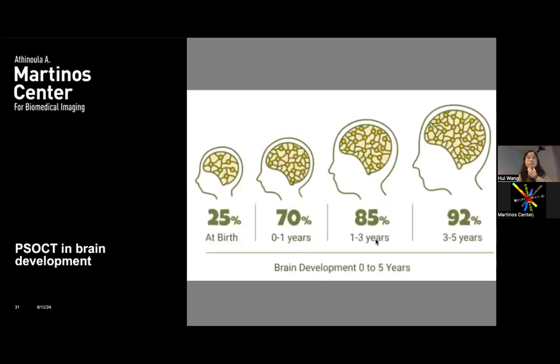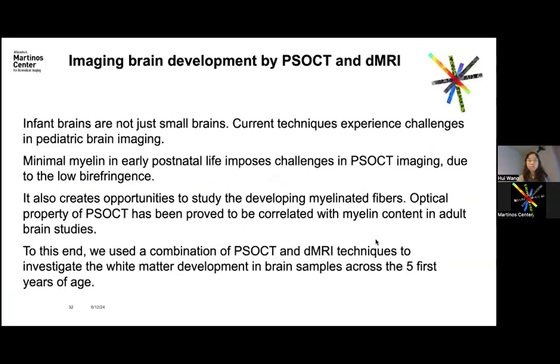And for the very last few minutes, I'm just going to briefly show the PSOCT usage in brain development. For people who are doing pediatric imaging, we all know that infant brains are not just small brains in size. The brains are highly underdeveloped, and current imaging techniques have challenges in imaging pediatric brains.